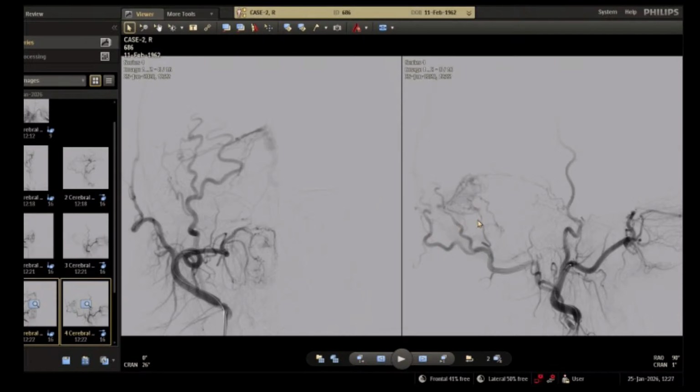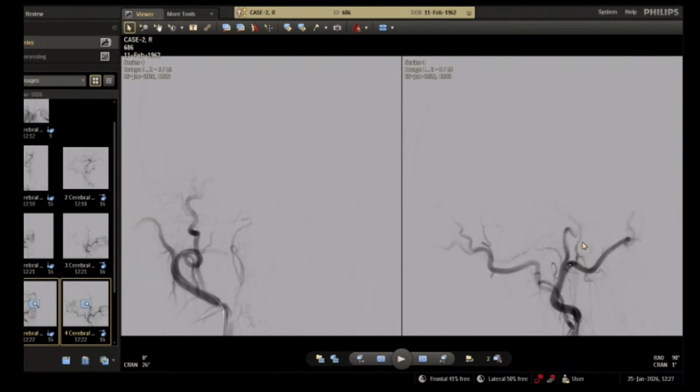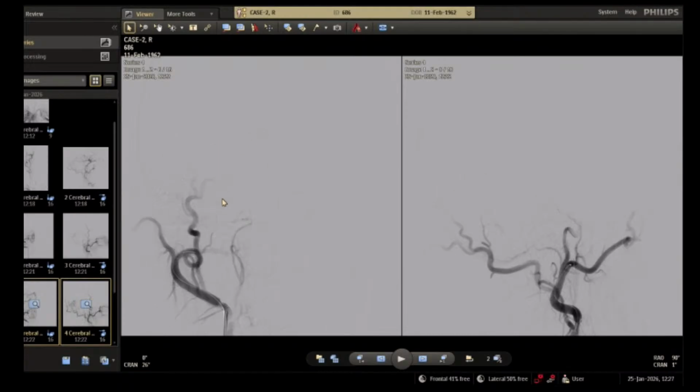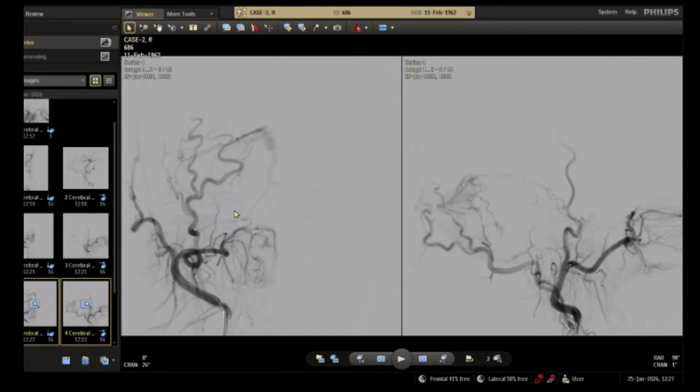This is an occipital artery, no meningeal artery, but maybe this one is meningeal. But it looked like ascending pharyngeal artery branches. No, it's a meningeal, and it's going a little bit through the dangerous territory. But if it's possible, we can go there.